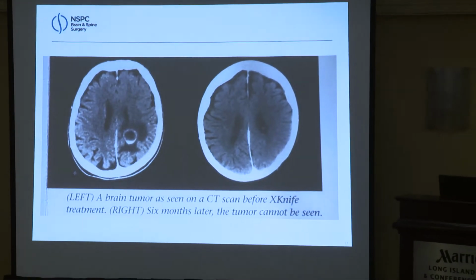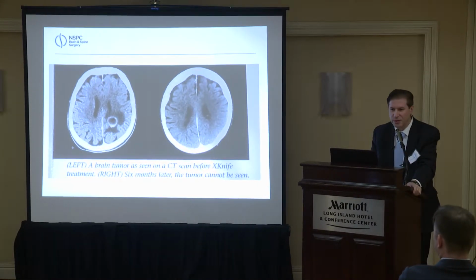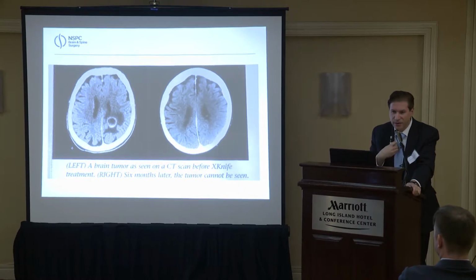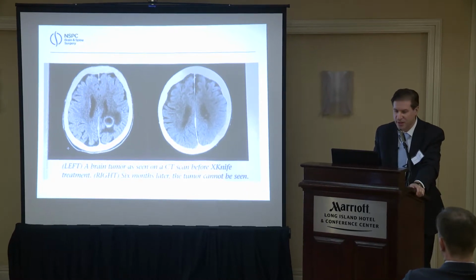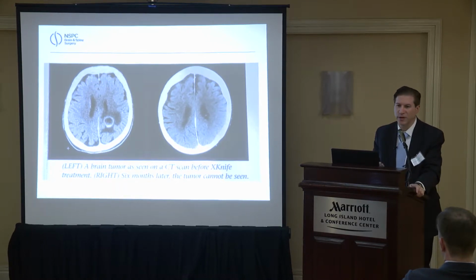I think subsequently there have been studies where they've looked at, well, what if you just did radiosurgery? Now it's really the same thing as cutting it out. And I think the feeling is, and my feeling is, that Gamma Knife and brain radiosurgery is the treatment of choice for most brain metastases. I think if there is a big thing on the surface, they're herniating, there's a lot of midline shift, I think removing it is reasonable.